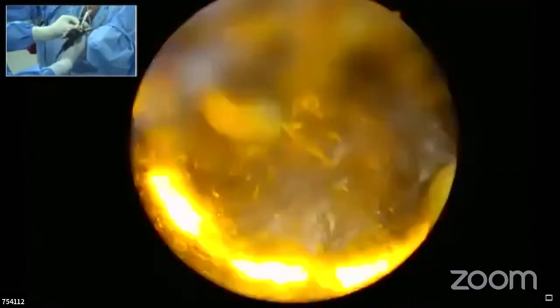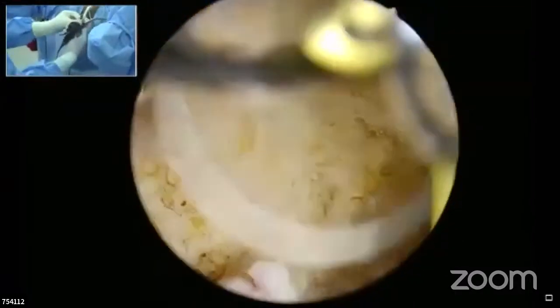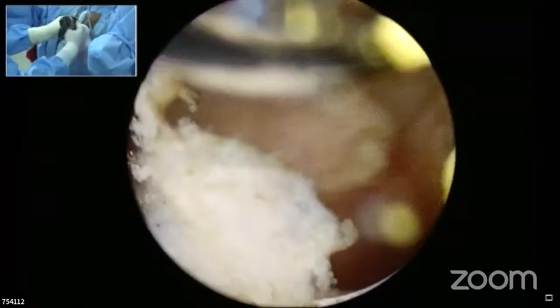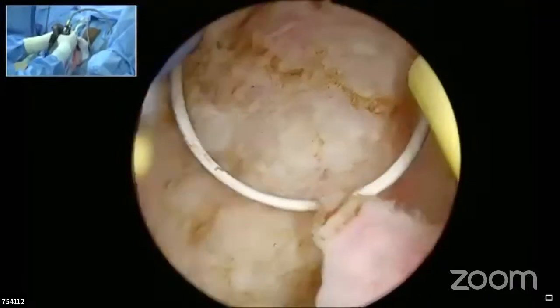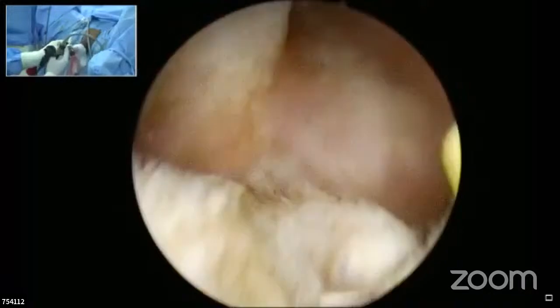One small point which I always say for juniors was whenever there is a perforation like that, don't try to resect the tissue around the perforation. Most of the time there is an extravasation which lifts the tissue there and falsely looks as if there is some adenoma. So leave some adenoma even if it is there around the perforation. That will be better off rather than trying to flatten the whole thing and make it look good.